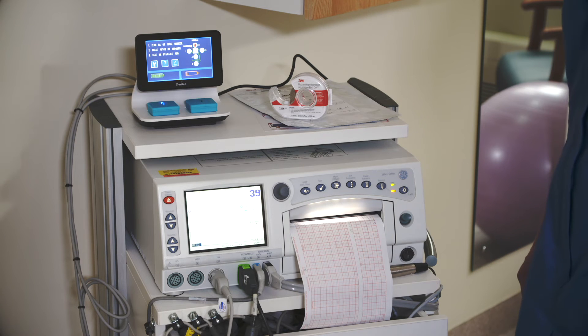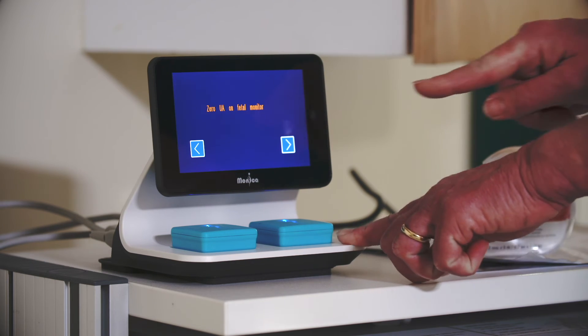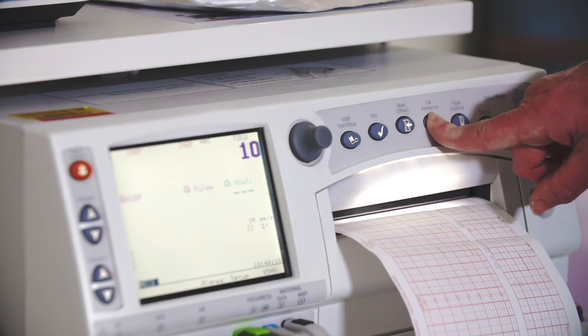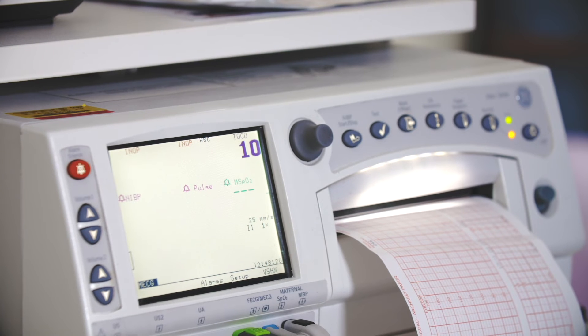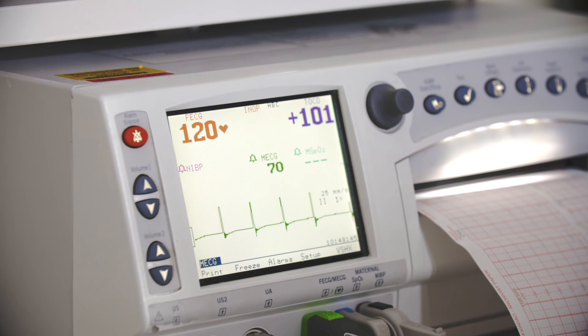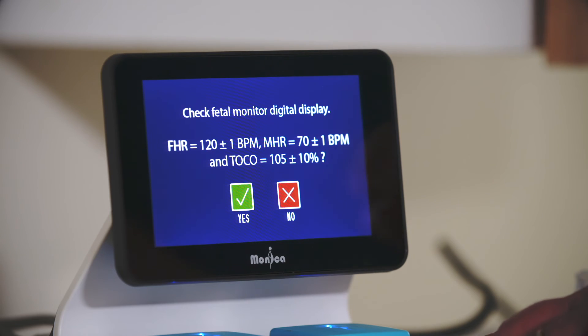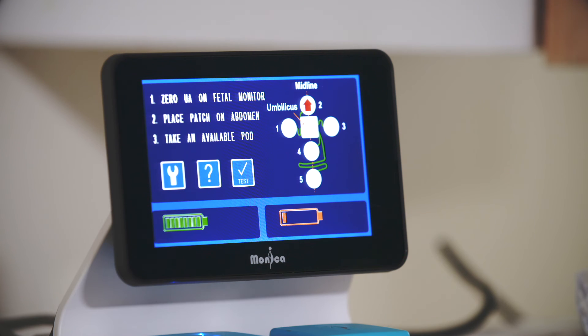Whenever you move Novi to another room and connect it to a monitor, you should run a test to make sure that the cables and connections are working correctly. When you press the test button, you will be asked to zero the UA reference button on the monitor. Confirm that this has been done by pressing the forward arrow button. Novi will now send an FHR, MHR, and UA signal to the fetal monitor. Check that the fetal monitor displays the test values as shown on the Novi display screen. If correct, press the green Yes button, returning Novi back to the start screen. If you do not see the correct FHR, MHR, and UA values, press the red No button and follow the instructions.